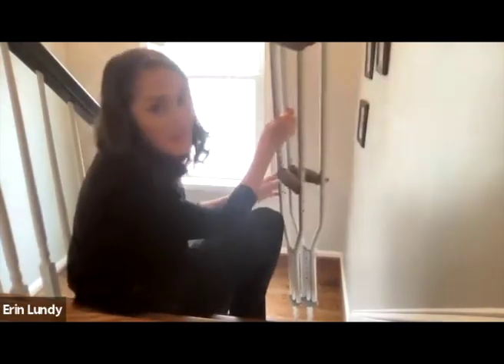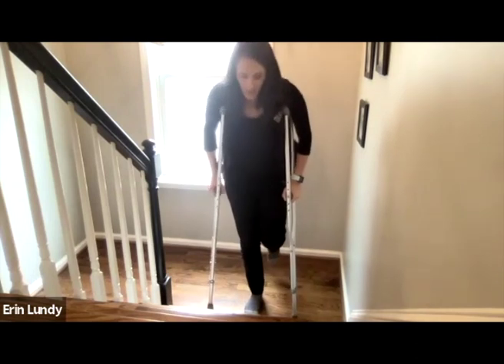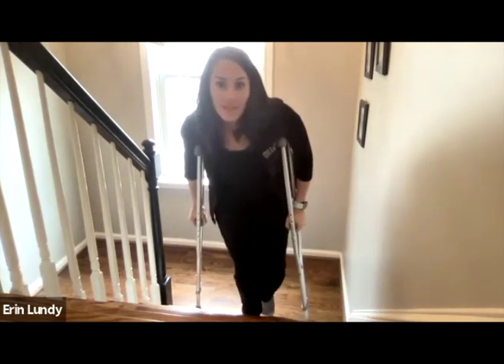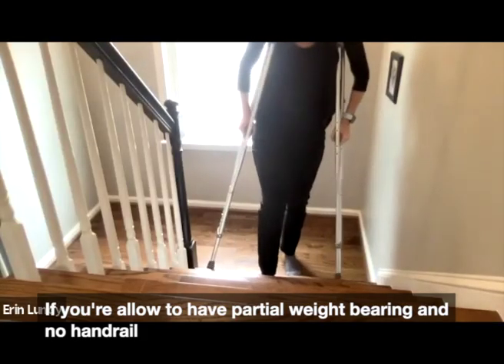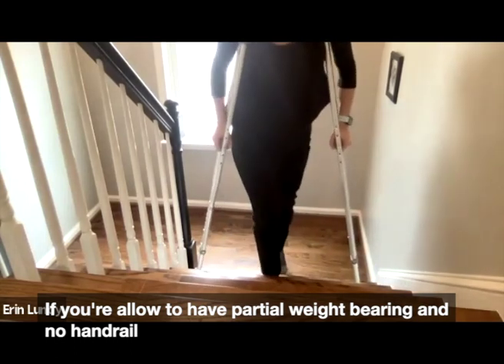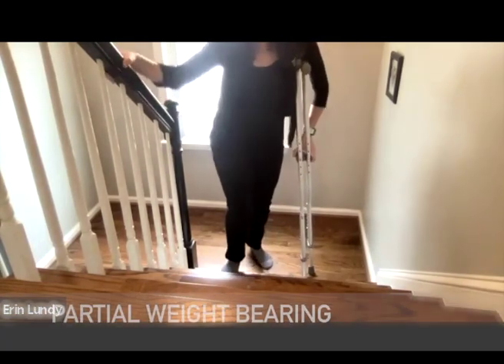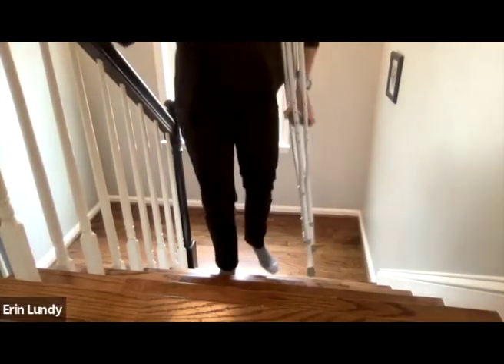So next up is if, let's say that you don't have any handrails at all, that can be pretty scary. Injured leg, what you're going to do is bring your non-injured leg up first. I'm going to step and come up. Let's say that your kid is allowed to put a little bit of weight on their leg. What you're going to do is go up with a good, so this is my hurt leg. So I'm going to go up with my right first, and then with my left. I'm going to go up with my right leg first, put all my weight through that right leg, then the left leg down.